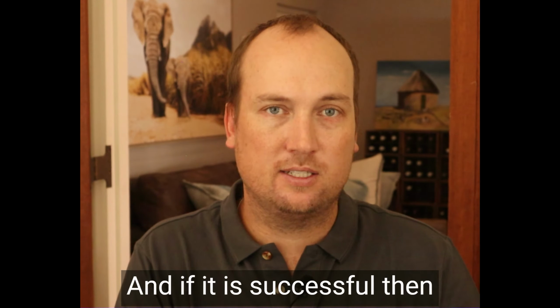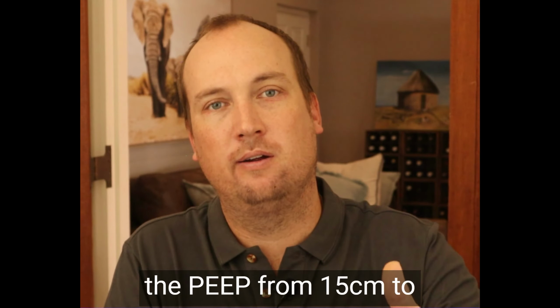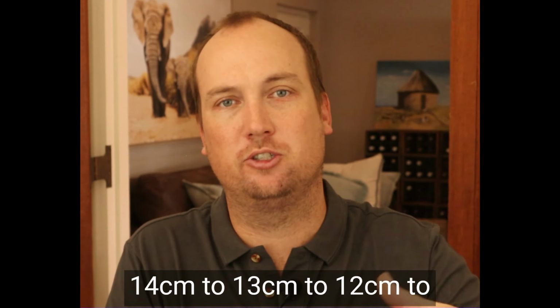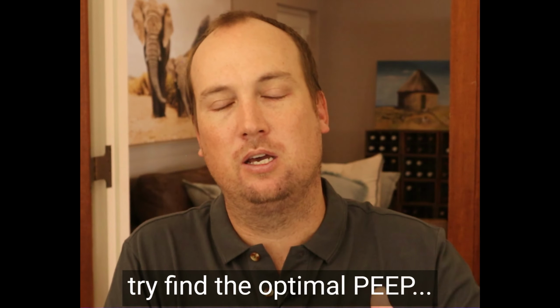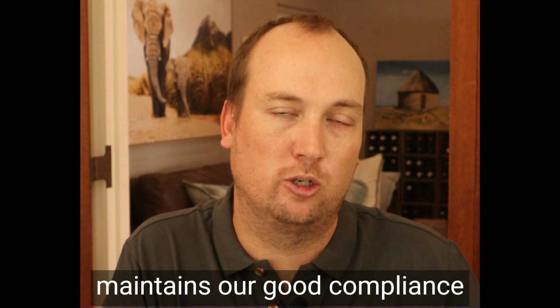And if it is successful, then one can slowly decrease the PEEP from 15 centimeters to 14 centimeters to 13 centimeters to 12 centimeters to try find the optimal PEEP, the lowest PEEP level that maintains our good compliance and good oxygenation.